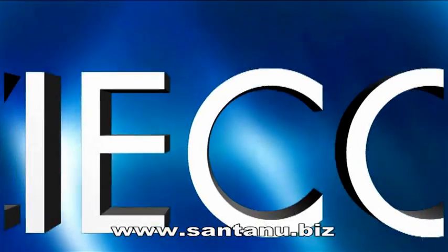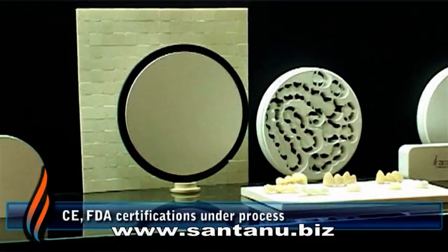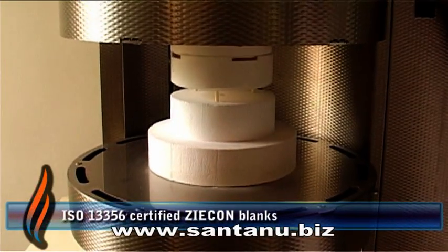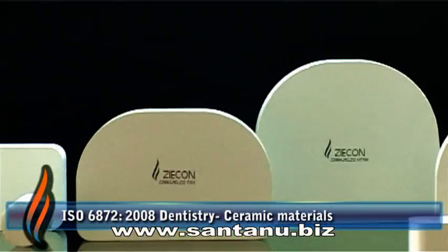Making Zycon the future of dentistry. With a commitment to bring you the same international quality, Jyothi Ceramic ensures stringent quality control methods at each stage in manufacturing, from raw material to final product.